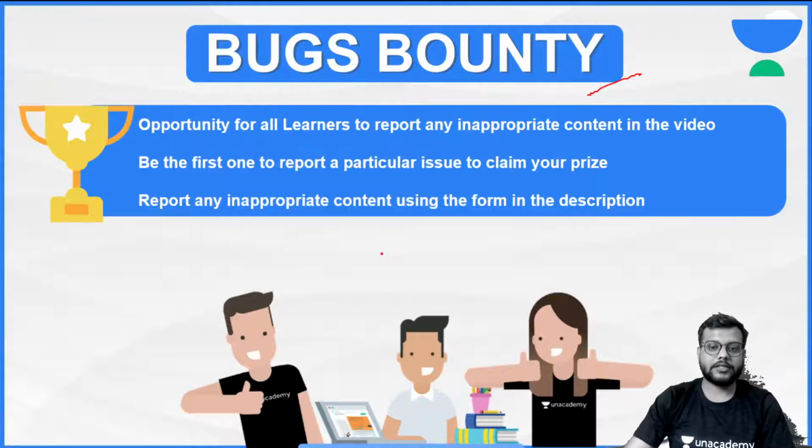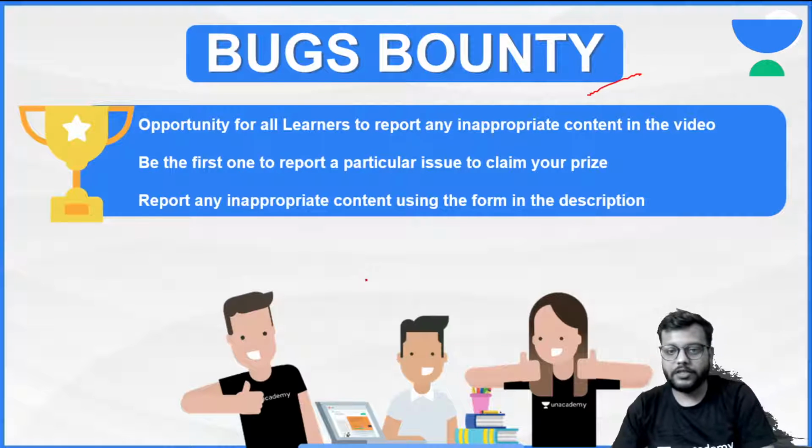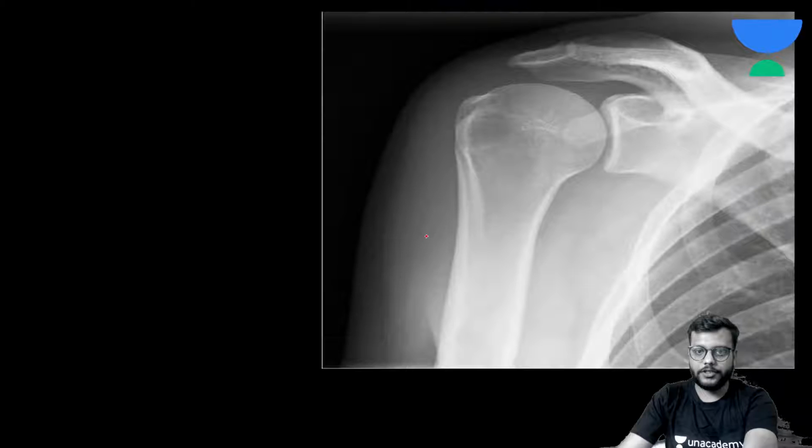Okay, so let's start today's lecture. As I have mentioned earlier, what will we study today? We'll study about upper limb orthopedics with the use of X-rays. Okay, so let's crack NEET PG.